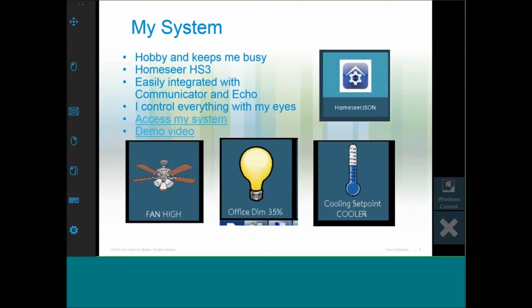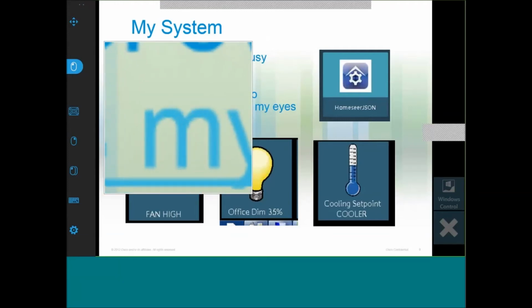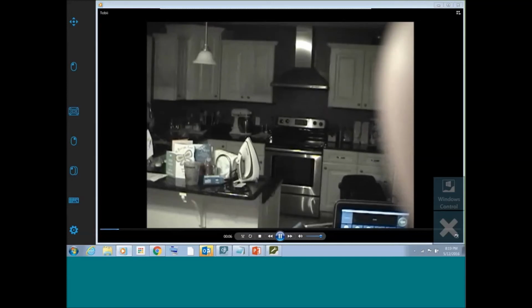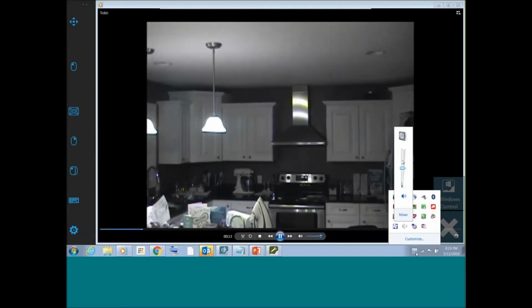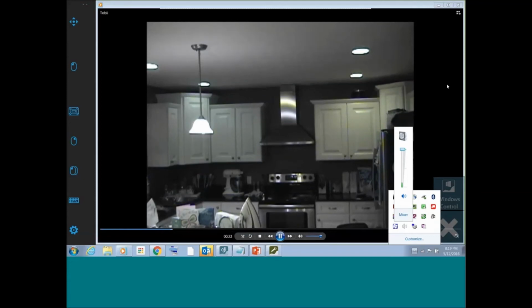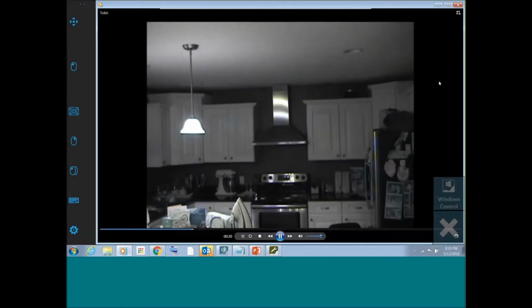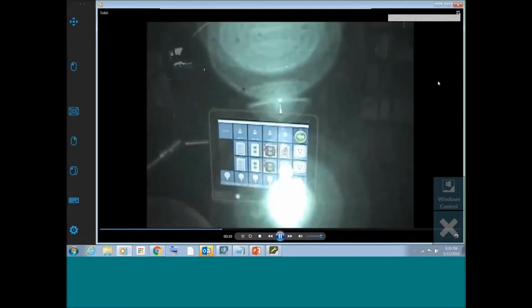Here's a quick demonstration of my system and how I control it with my Toby. Josh is going to turn some lights on in the kitchen. Josh is going to turn on the fan and some lights in his office.